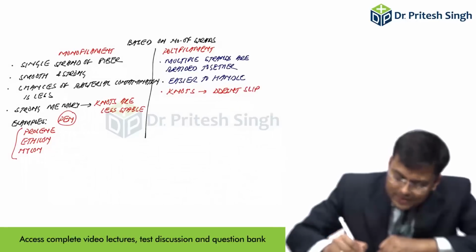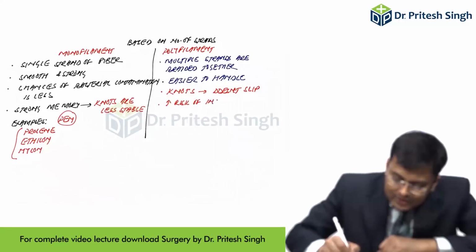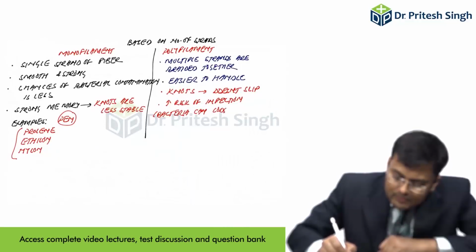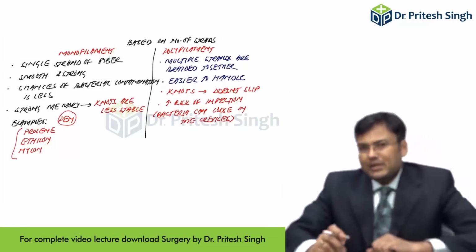But the disadvantage: increased risk of infection because bacteria can lodge in the crevices. That's why in cases of infection, we avoid polyfilament sutures.